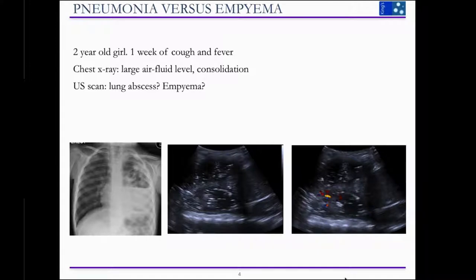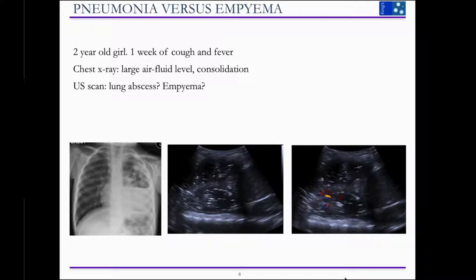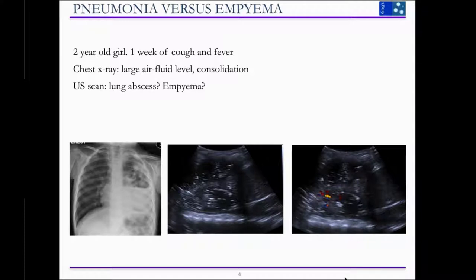Everyone at the moment is trying to manage pediatric patients far more quickly and efficiently than before — getting to a diagnosis quicker, treating sooner, and discharging earlier. This was a two-year-old child who presented with a week's history of cough and fever. On the chest X-ray you can see an abnormality in the left lung with large air-fluid levels and areas of consolidation. The question always is: is this a cavitating pneumonia, a lung abscess, or an empyema? Grayscale imaging doesn't necessarily give you much of a clue.